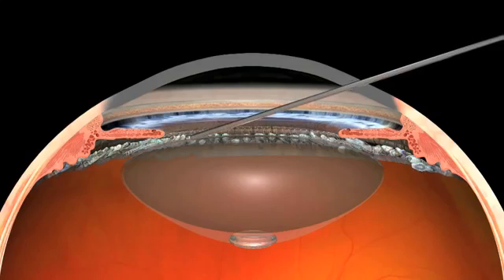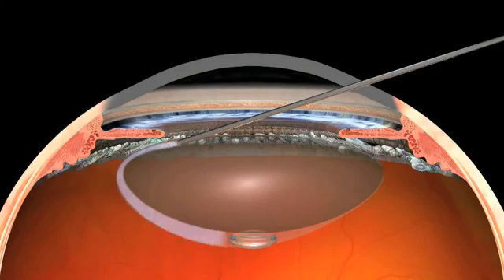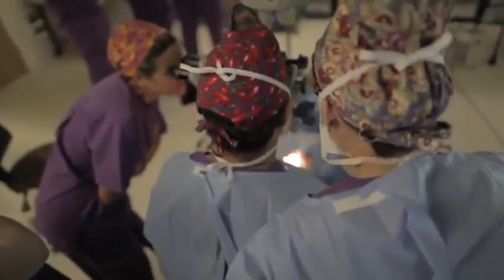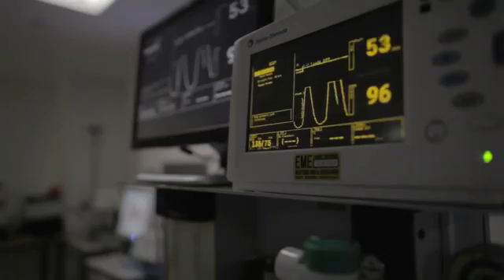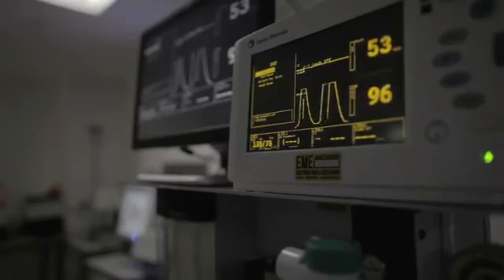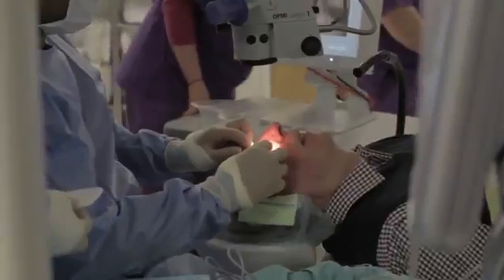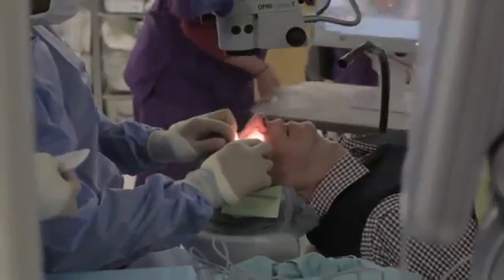This animation illustrates the phenomenon of capsular block, again showing distension of the posterior capsule and forward movement of the nucleus. For this reason, many laser cataract surgeons perform hydrodissection cautiously, or not at all, preferring to break up the lens with a chopper, releasing lenticular gas, and then shoehorning each nuclear fragment.